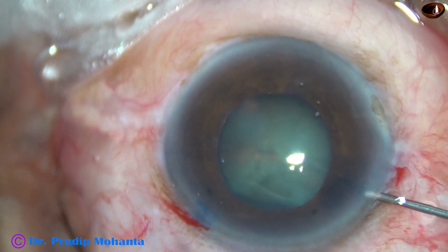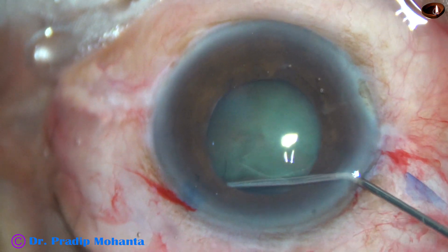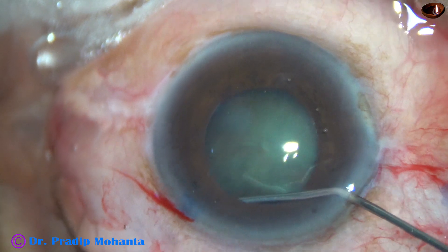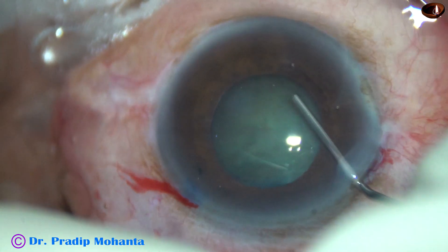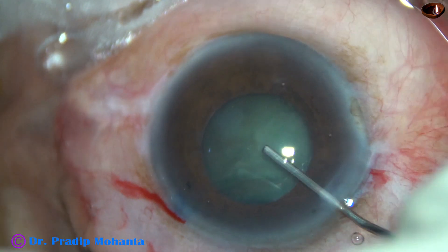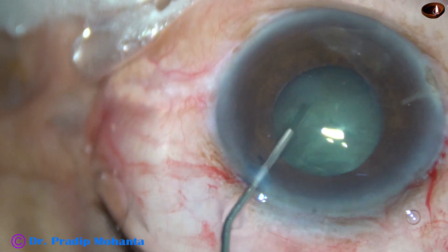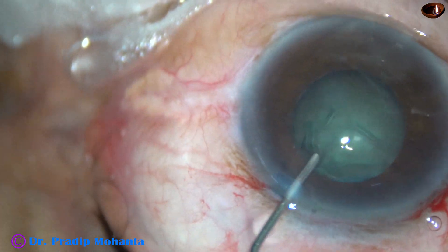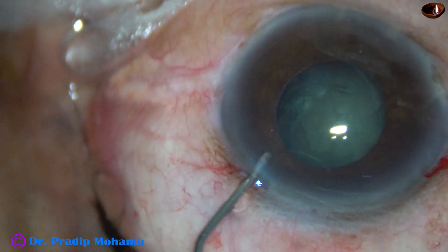And now hydrodissection is done. Very gently, BSS is passed — a small amount of BSS is passed. The nucleus is tapped, and I try to rotate the nucleus. And it rotated ultimately.